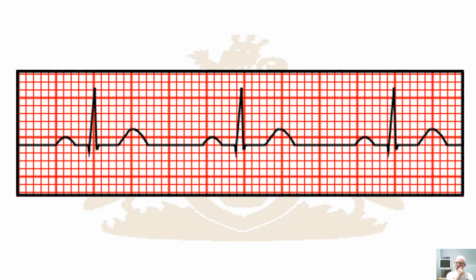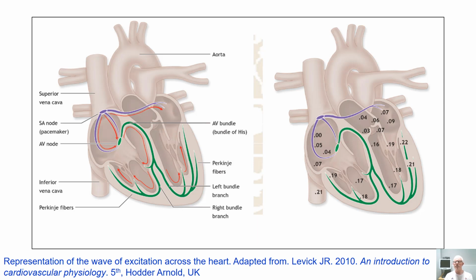Now, clearly, what you can see in the signal is there's an awful lot of other things going on. You can see a number of peaks and troughs within the signal, and these relate to the electrical activity that we're seeing here and those time responses. Remember that we were talking about the fact that you've got to view the heart in 3 dimensions, and you've got to view the notion of this wave of excitation happening across different areas at the same time.